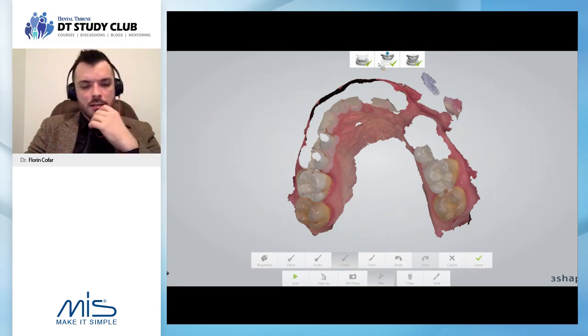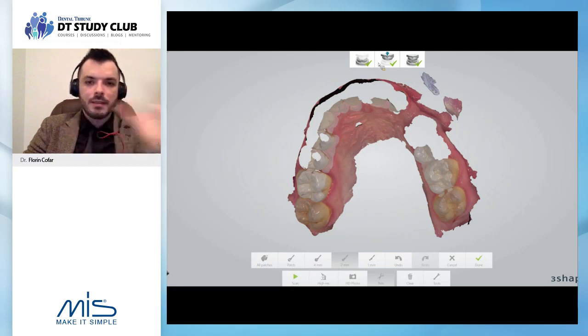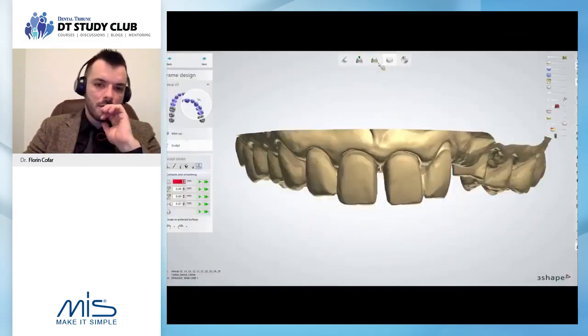we're doing in this kind of case, in order for nice alignment, because alignment is one of the big issues when we're talking about cases like this, is instead of ever getting to the point where you need to align two scans, you always make a copy of the original scan, a standard copy, delete the area that you modified, and simply rescan that area, and this will give you a very, very nice alignment.